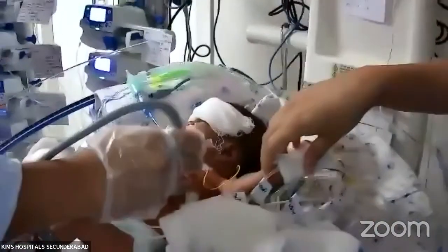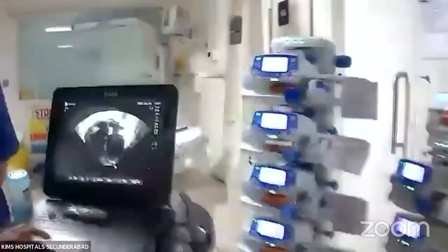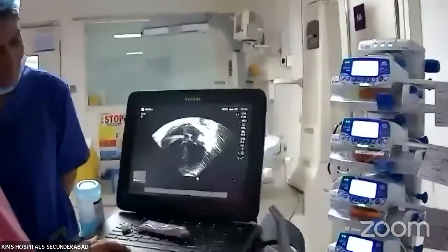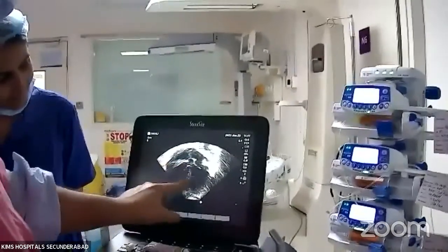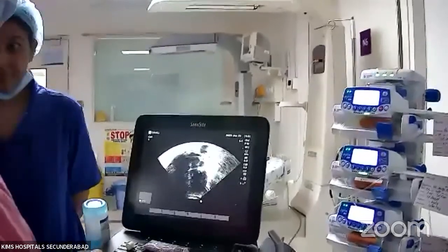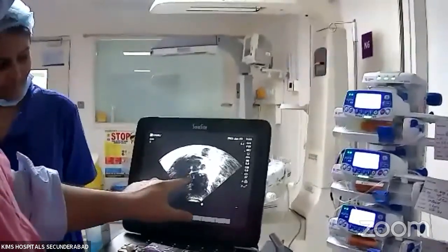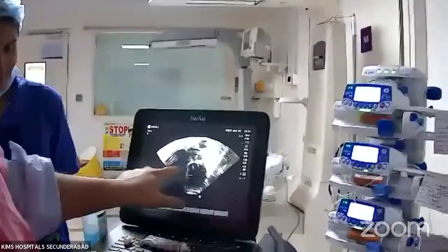You see this probe, this marker should be at the left shoulder apex. See. Now you can see the four chamber. Now I'll show the live. See, this is more corrugated. This is smooth. This is having the moderator band in this leaflet. This leaflet is lower and more septophilic, means it's more touching the septum. See, now you can see this is more touching the septum.